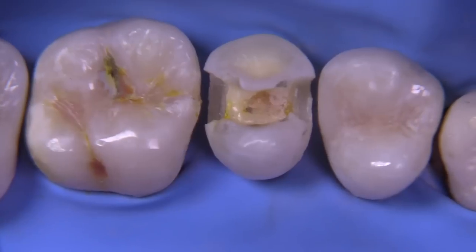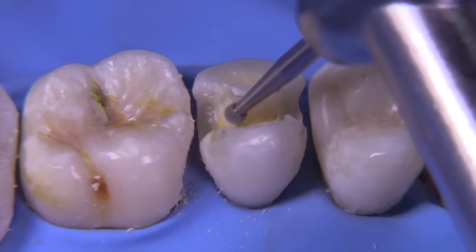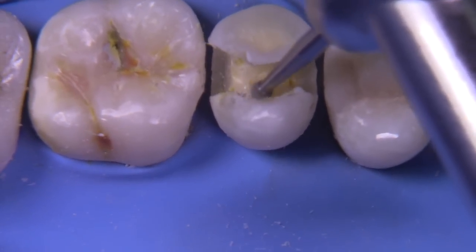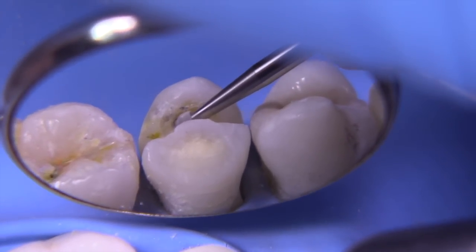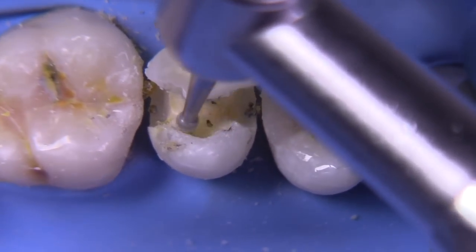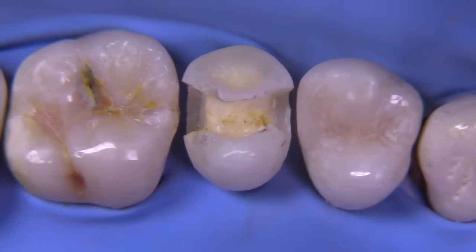Rather than removing the cusp right away, let's take a look at how undermined it really is. We're going to use the slow speed round bur. You can see in the mirror just how undermined that cusp is — there's even some amalgam still left in there. So we're going to go after that area with the slow speed, undermining the enamel and then going back and removing more enamel. A significant amount of undermined carious tooth structure has to be removed. We want to get the DEJ absolutely clean. Sometimes you can't see it and you need to expand the outline form from the occlusal, but other times you can look up underneath the cusp and see it pretty easily, like in this particular case.